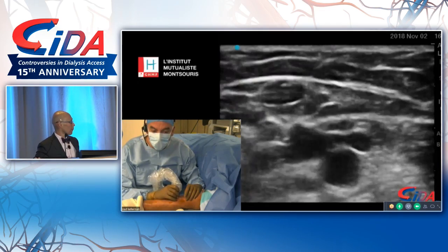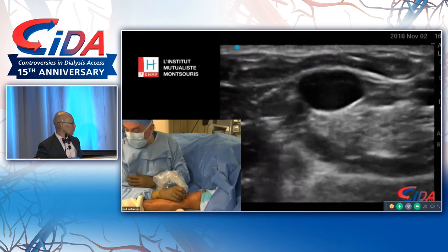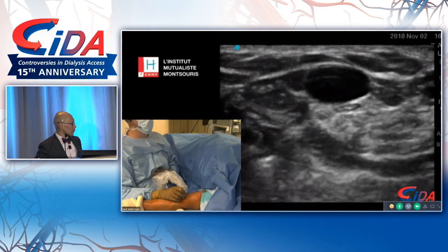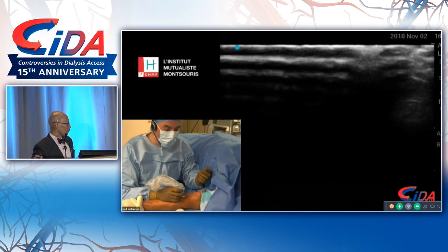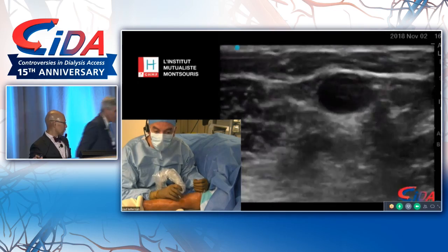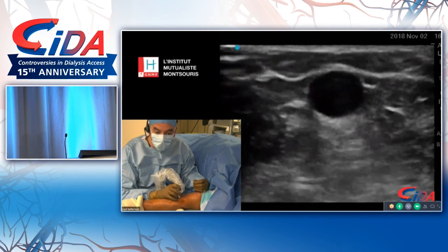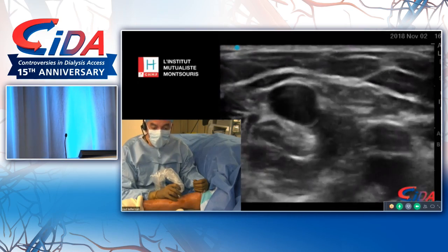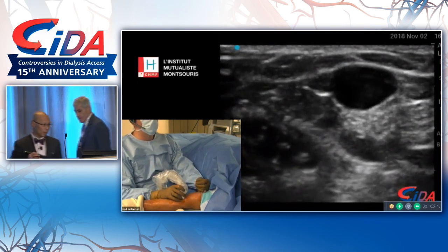You can just talk into him, what he's saying. Yeah. Okay. Are you guys okay? Can we start the case? Yep. Jeff, rock and roll. You're going to approach this through the median cephalic vein? There's no median cephalic vein in this patient. You just speak into the microphone. Okay, Aris, are you okay? Can I start the case? Yeah, you can start.